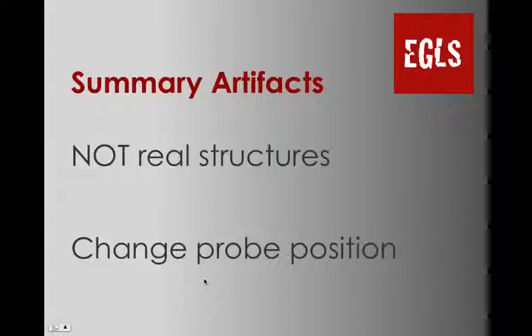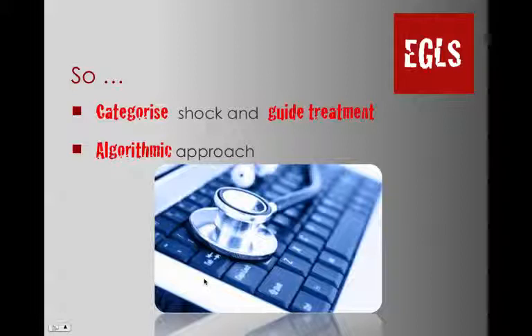Artifacts are interpretation errors done by the machine. They sometimes disappear when we play with the settings or if we change our probe position, if that's an option. But most of the time we're kind of stuck with them. So we have to subtract them from the interpretation we'll be doing of what's on the screen. Now remember that what we want to do with ultrasound is use it in the clinical context. So always keep that in mind when we come to the course.